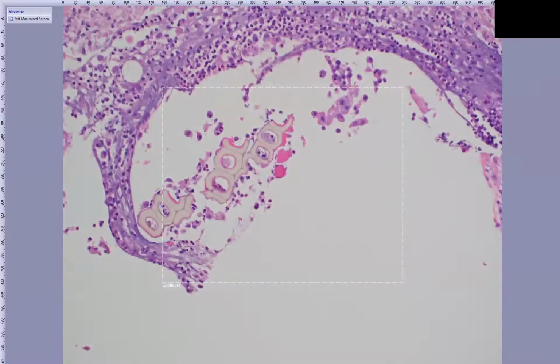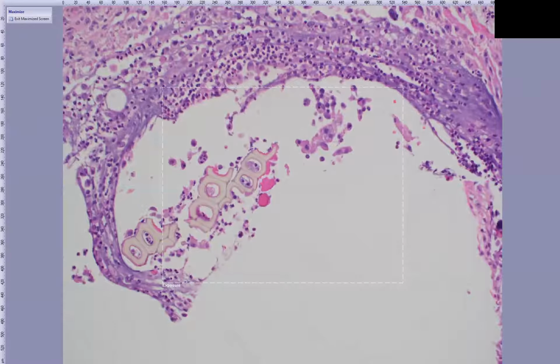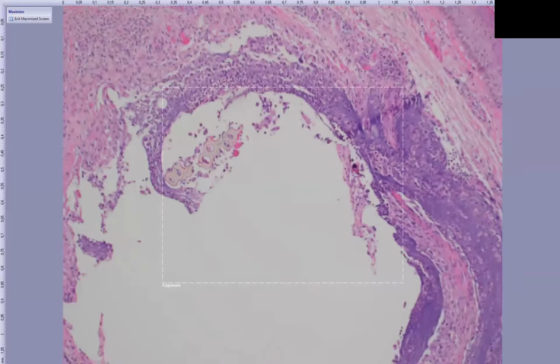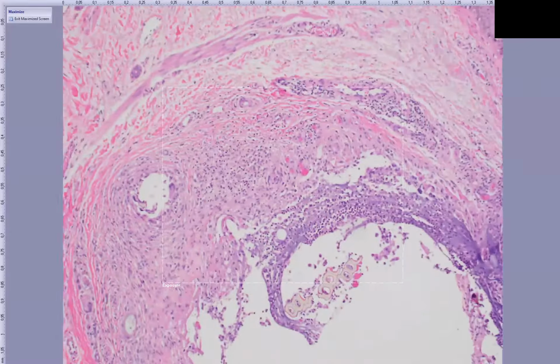It's really important when you have wood splinter associated granulomas or inflammation to get bug stains, special stains for bacteria and fungi, because they can be carriers for these organisms and can cause localized infections. All right, so that concludes a few examples of foreign body granulomas.